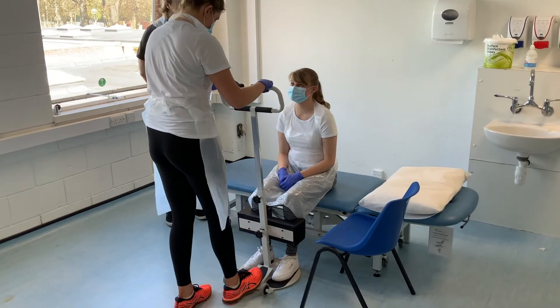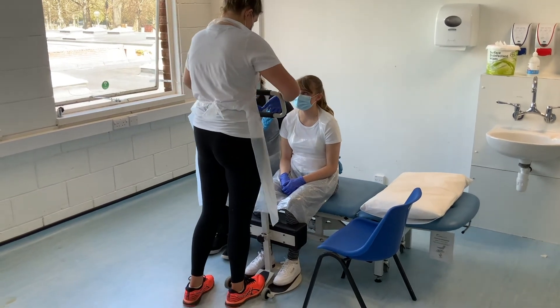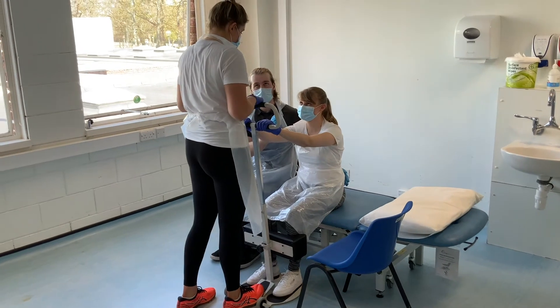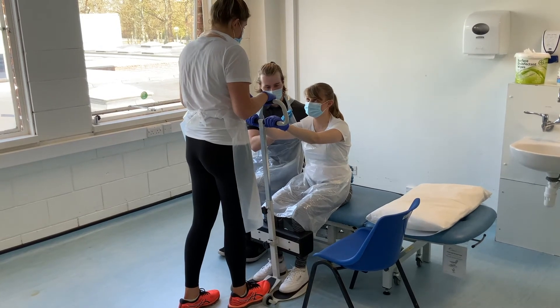I'm just going to fit this up to your feet. Does that feel comfortable? So I'd like you to push your hands up here, and under the command ready, steady, stand, I would like you to stand up. Okay, so no rush David — ready, steady, stand.